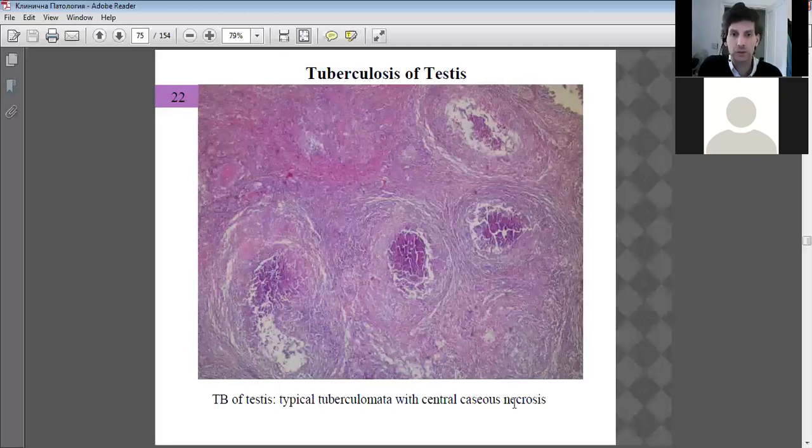Caseous necrosis, yeah, death. So wherever you're looking at caseous, you're thinking of calcium deposits. Necrosis is spread throughout all the dark patches here. Dark patches is necrotic tissue. There's some bits of it here as well forming.